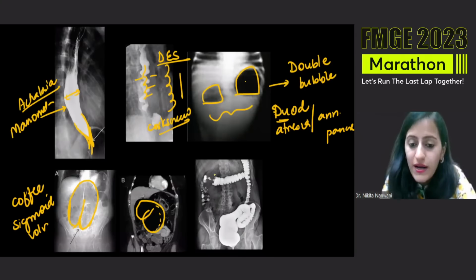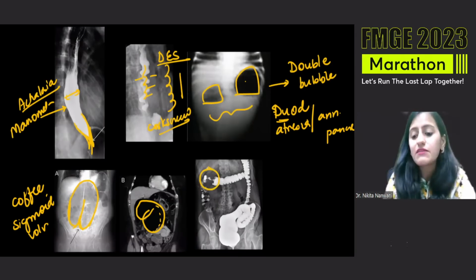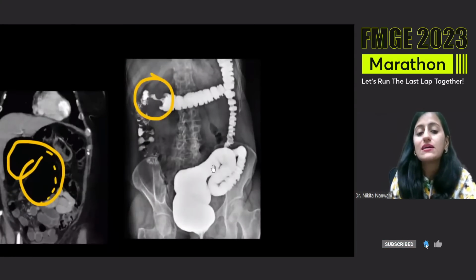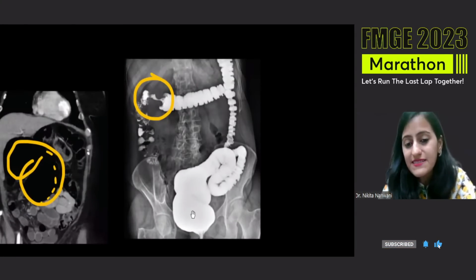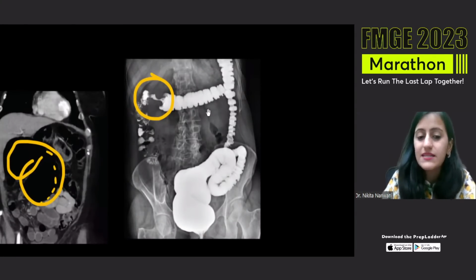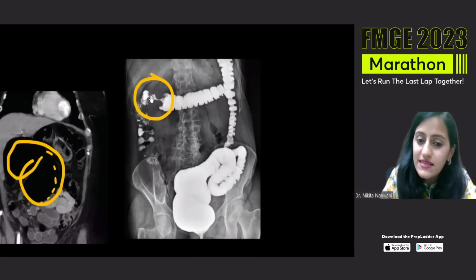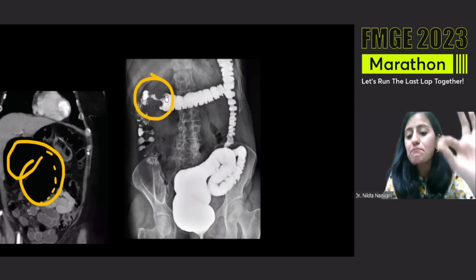Okay? What is this image showing here and what is the investigation here, guys? What is the investigation and what is the diagnosis? The investigation is the barium enema. It is not in the small intestine. And this is the narrowing in the colon. This is still, we are in the transverse colon. This is the narrowing that we are seeing like the apple core.